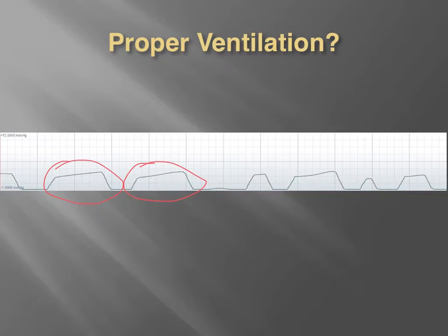You can see that the waveform is actually pretty decent looking, maybe a little bit of an upward slope. Maybe he was a smoker, which I think this patient wasn't the beacon of health, but the rate is rather quick, and then we have some irregularity going on with our bag valve mask ventilation as well.